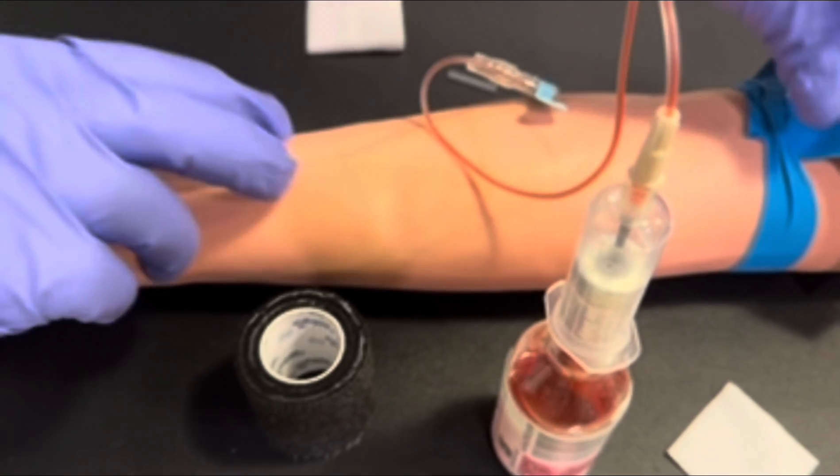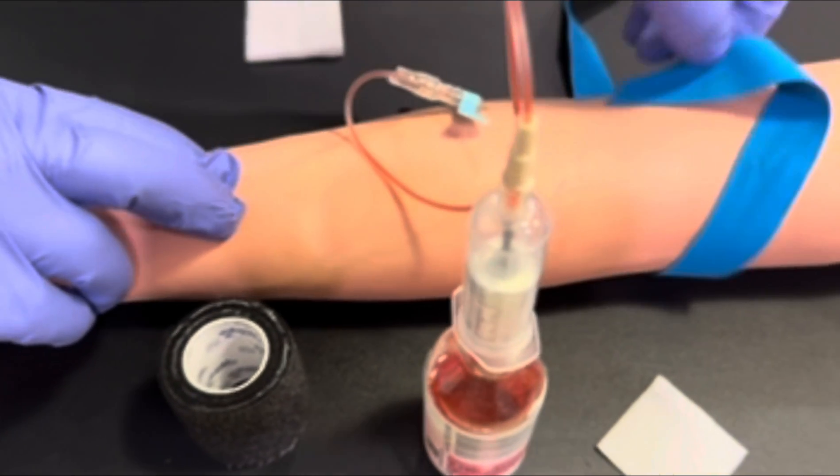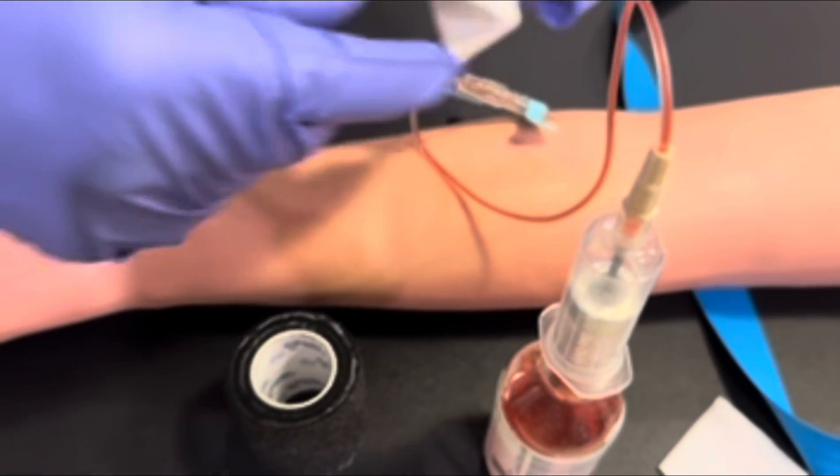With the blood culture that we're collecting, we will need anywhere between 1 to 3 mLs of blood.